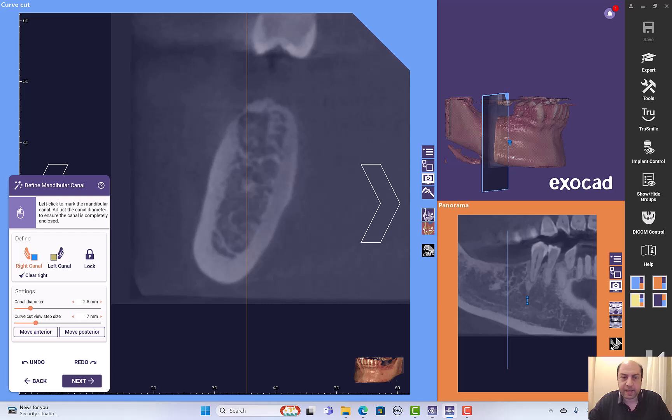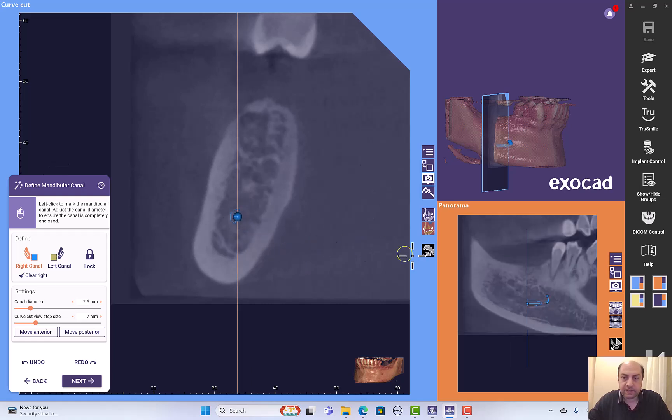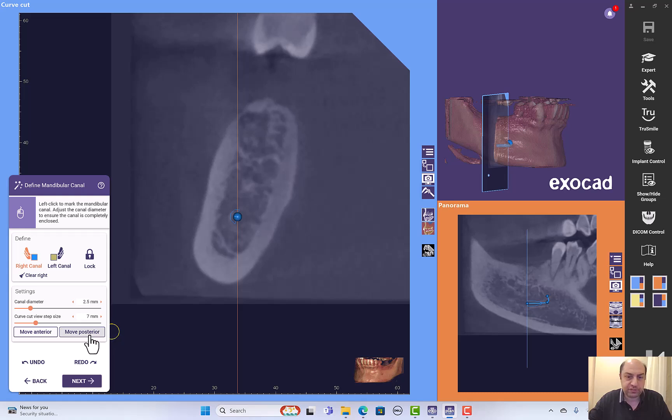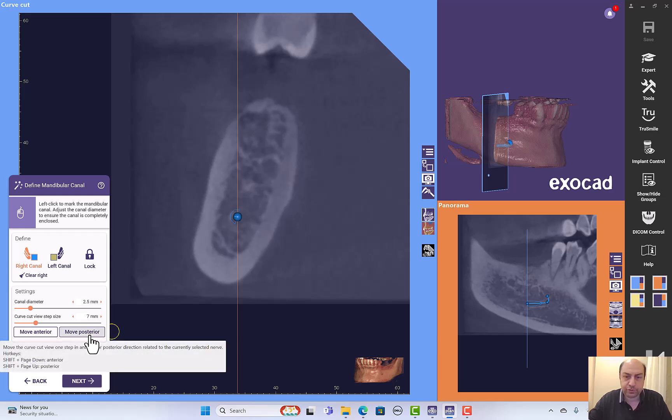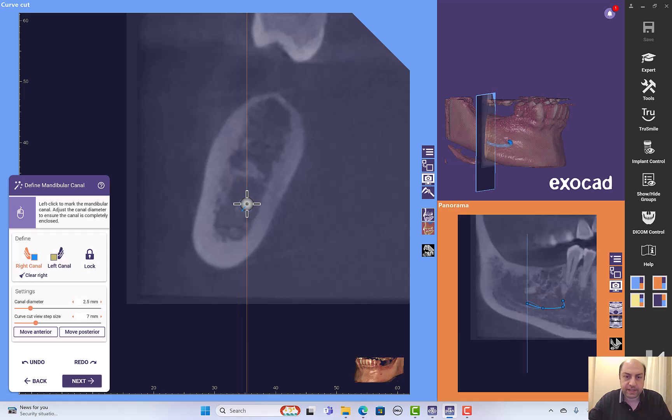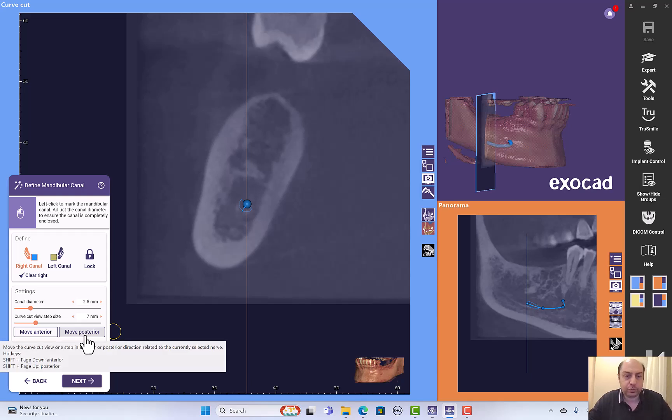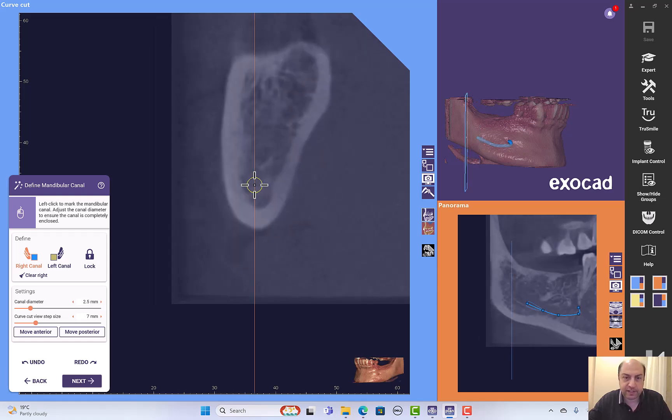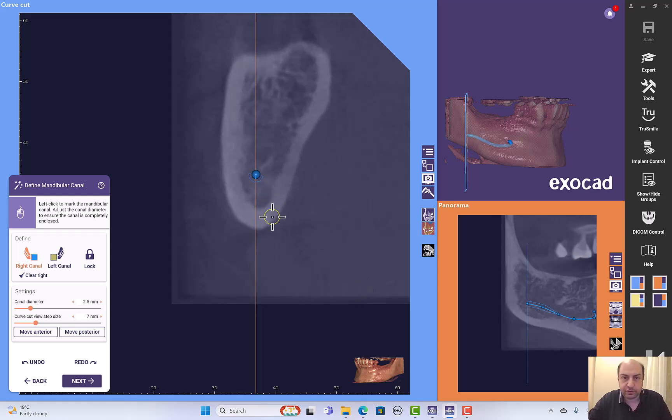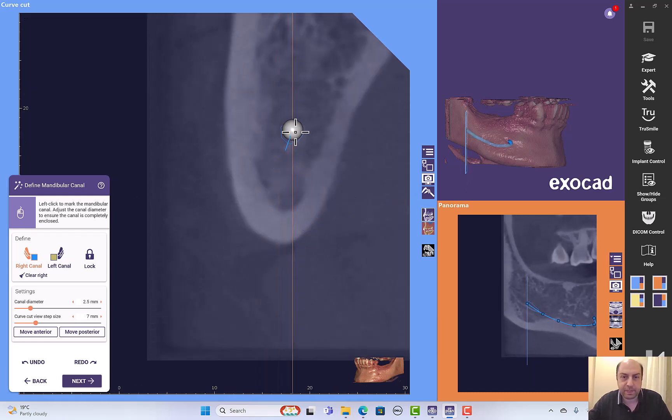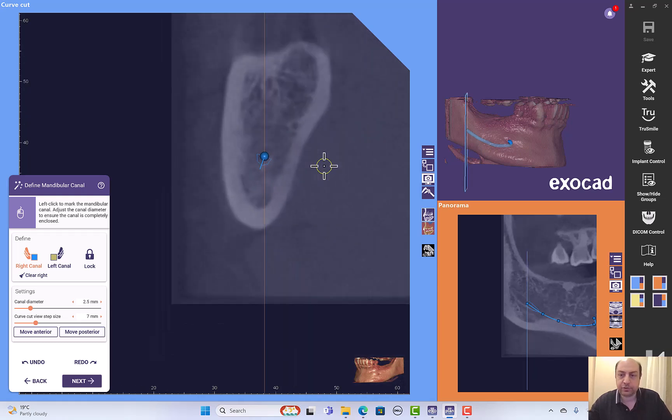This can be time-consuming, so here in the software we have move anterior or move posterior. If we click move posterior, we can put one point at the mandibular canal here. Or if you want to do it with a shortcut, I can move posterior and press shift and left click. Automatically the software will put the point and just go posterior, so I can put the points from posterior area to posterior area without having to navigate through the cuts.